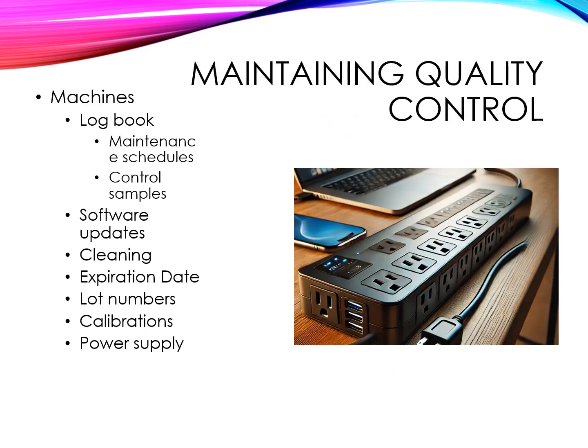So as a technician, whether you are running in-house machines in your clinic or if you work for a veterinary diagnostic lab, you would do quality control on your machines. Usually the machine reps will come by and answer any questions and show you how to do it. And then usually these machines have a manual as well that explains the quality control. So there are usually some control samples that may be kept in the freezer that are run through the machine. They are run like a regular sample and they're designed to come back with normal or within reference range values. And if they do not, then the quality control does not pass. So it needs to pass for you to run samples on it.